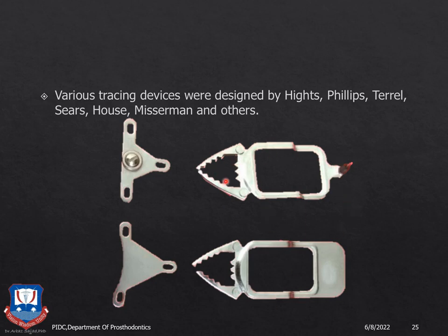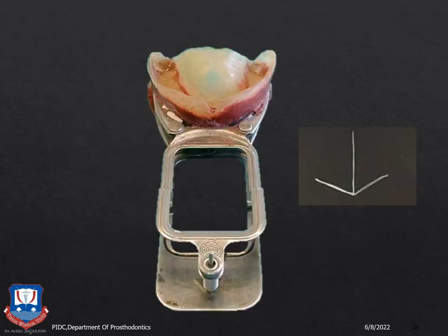So these forks or the prongs are attached to the upper and lower wax rims, and this is the central bearing plate, and this is the plunger or styli which makes a marking on the central bearing plate of this assembly. Here we can see more clearly. So in this, the styli or the plunger is attached to the upper rim, and the central bearing plate is attached to the lower rim, and then it creates an arrow shaped marking.